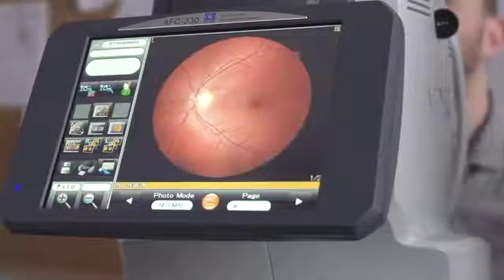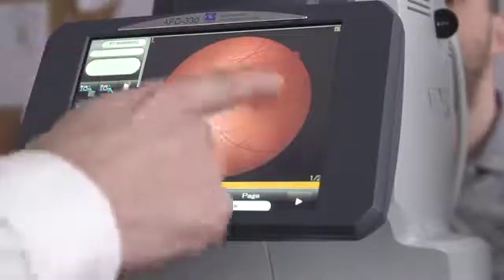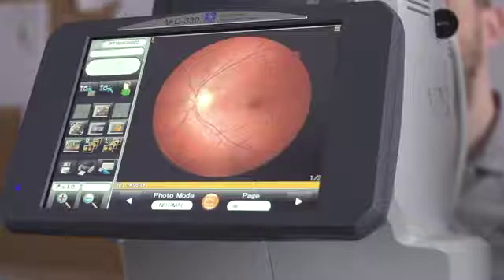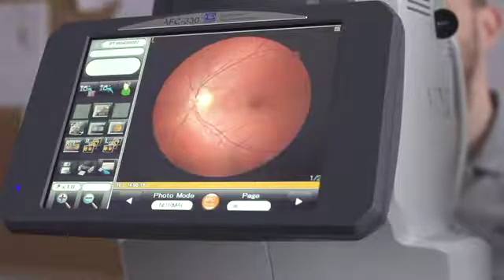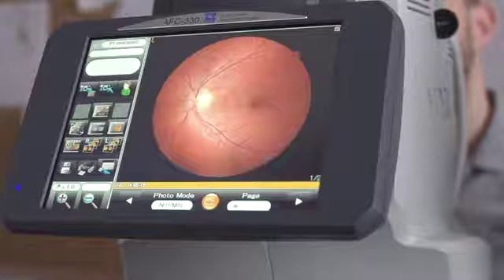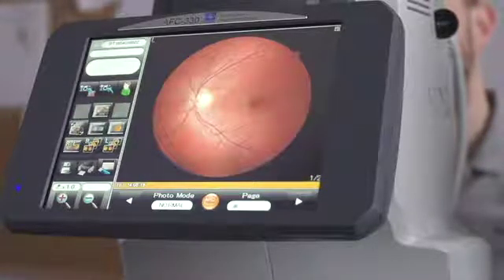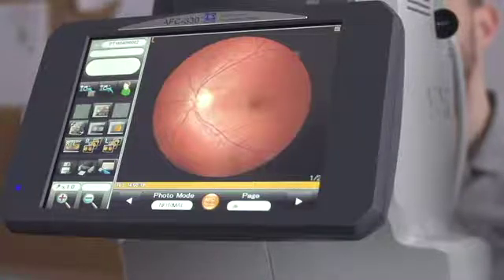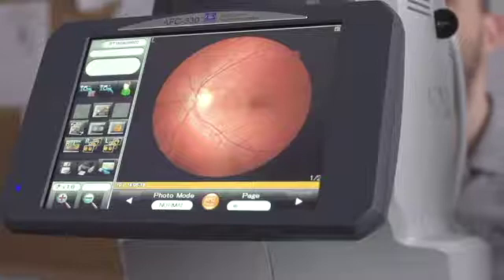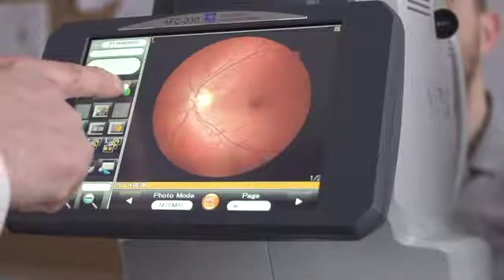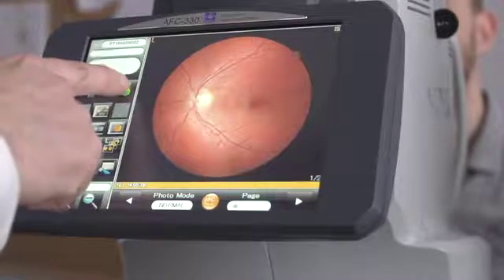Once we have taken all the photos, we are now in the patient thumbnail screen. If you have a practice management system which is linked to the AFC330, you will now be able to access the photos on that. If the AFC330 is connected to Navis X, they will now be available in the Navis X software. To return to the start screen to take other photos of other patients, just press the green man.